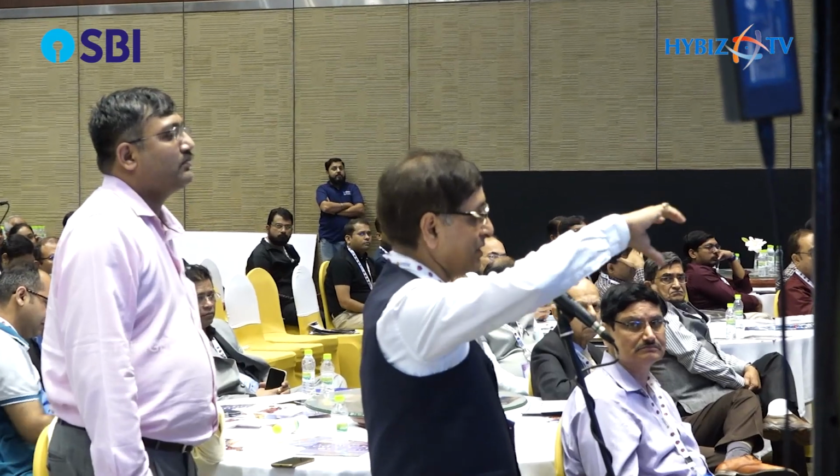In the case that you showed, where the circumflex was very tortuous and very badly diseased, after balloon dilatation there was a dissection, and it looked angiographically that the dissection was quite extensive. Now, how do you decide that a drug-coated balloon will be enough for this case, and that you would not stent it? Because you will have to take everything out, the wire out. And based on what do you decide?